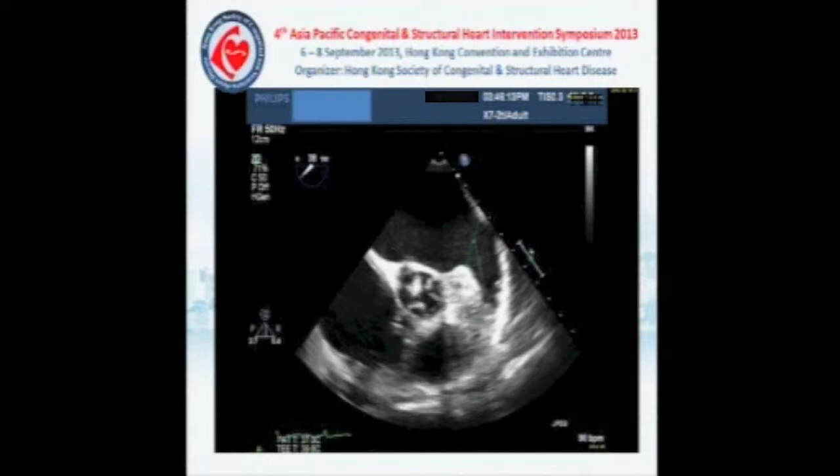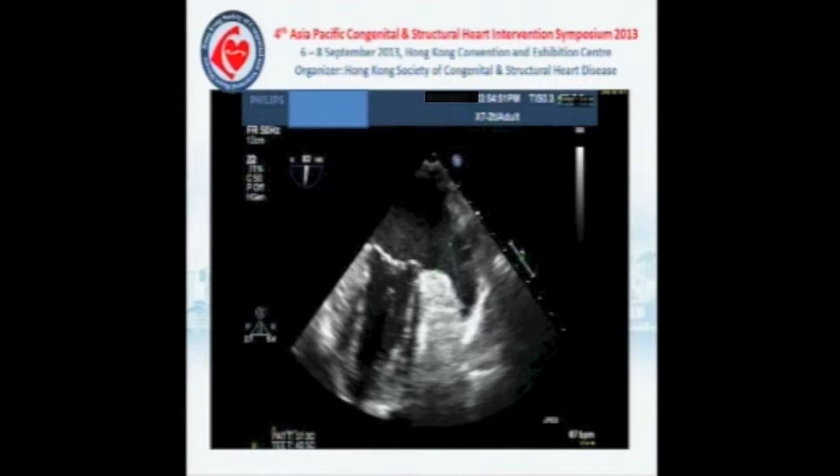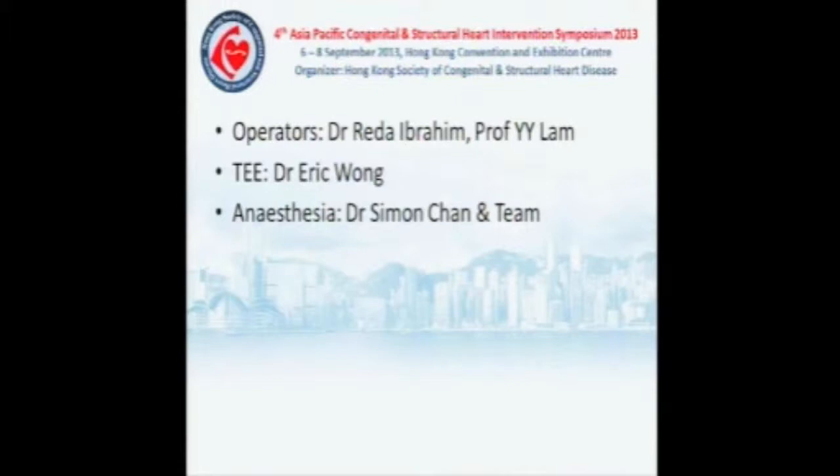We did some measurements. The orifice measures around 24 millimeters and the length of the LAA is around 34 millimeters. A similar measurement was confirmed in the 60-degree and 90-degree TEE view.